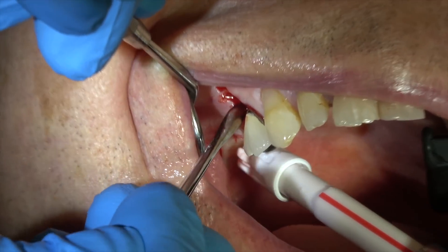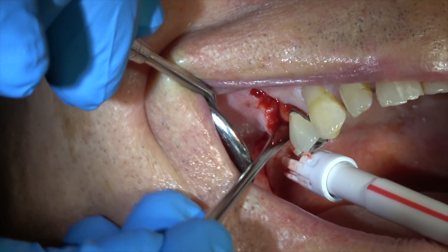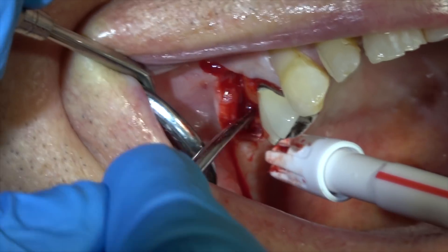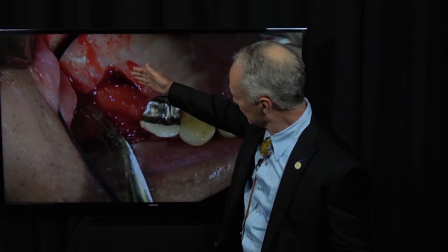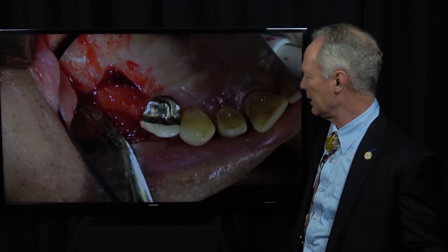Take your time using a periosteal elevator — I'm reflecting the whole flap to the buccal side. Now in this case I don't have a cone beam. The standard of care is either a pano and a lateral ceph or a cone beam, so I've got a pano and a lateral ceph — very simple, inexpensive radiographs. I'm going to supplement that with periapical radiographs of a pilot drill to determine the implant depth, the working depth.